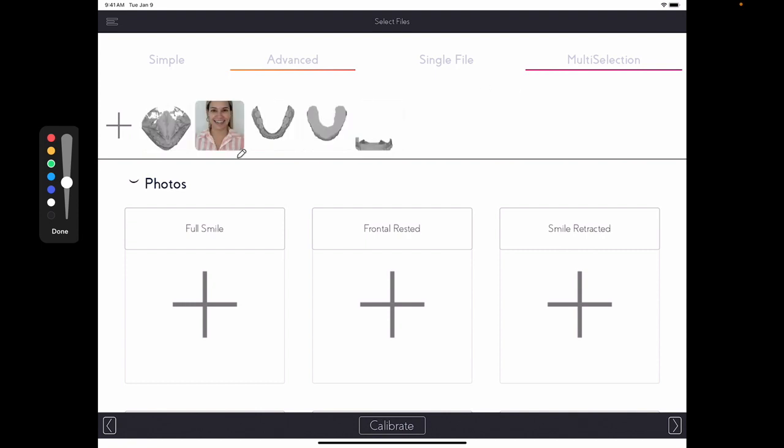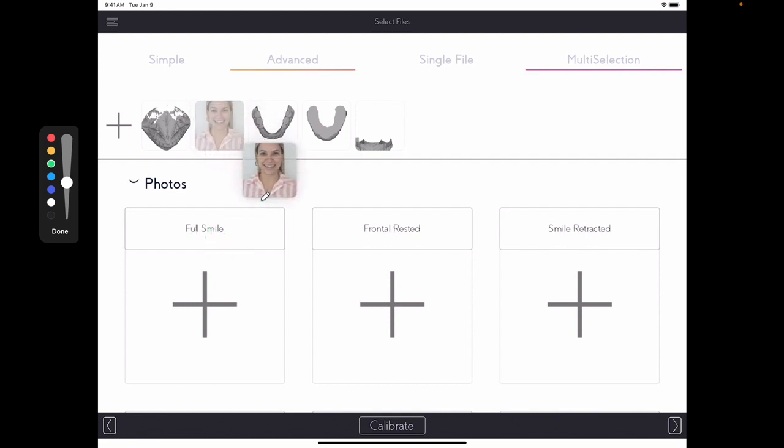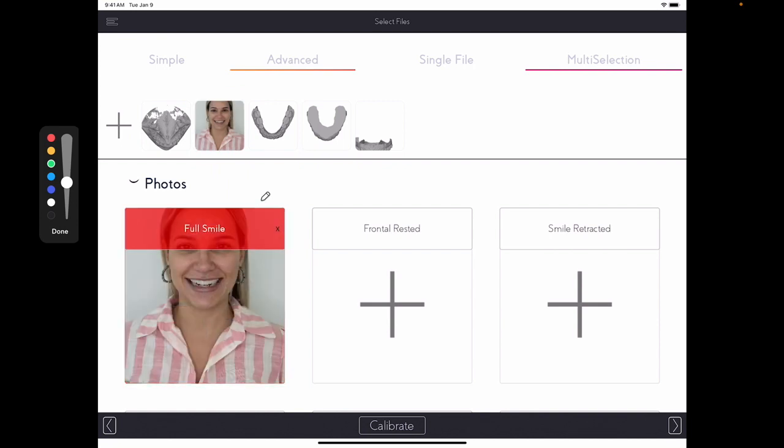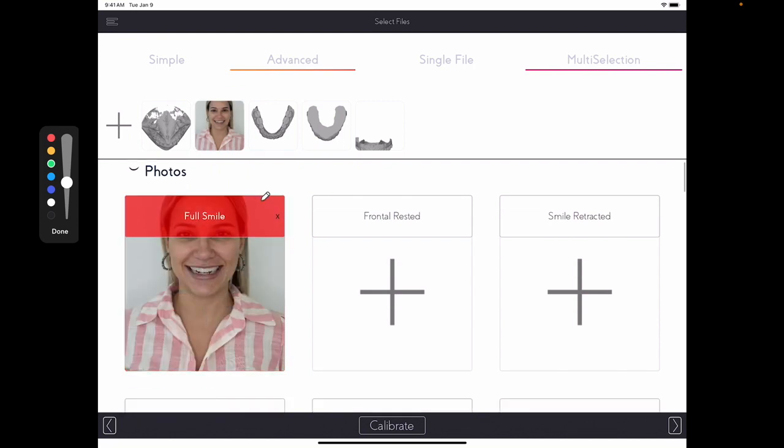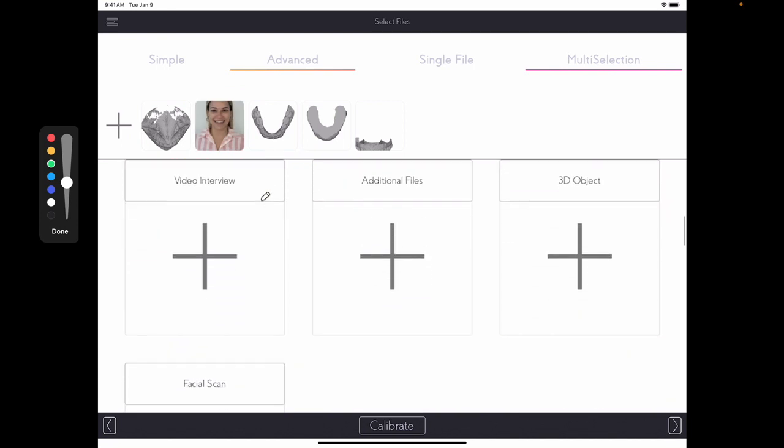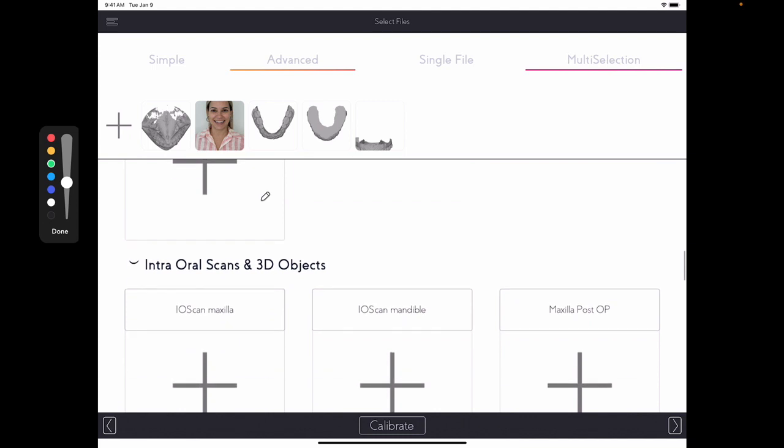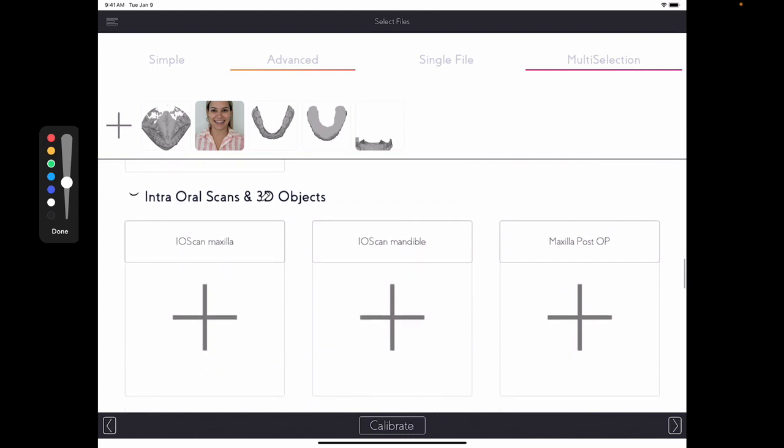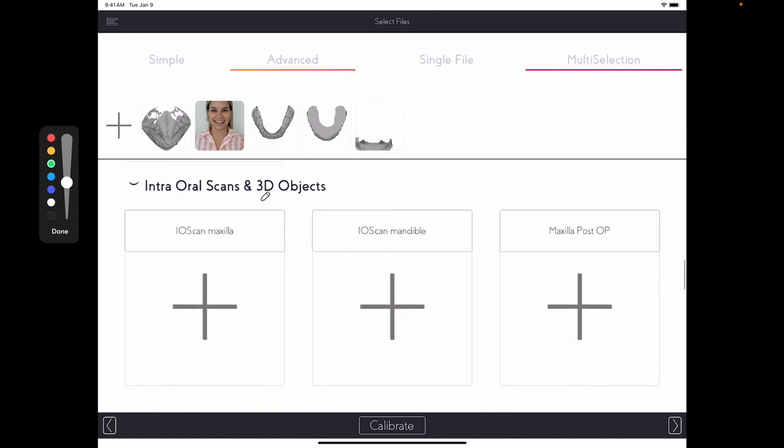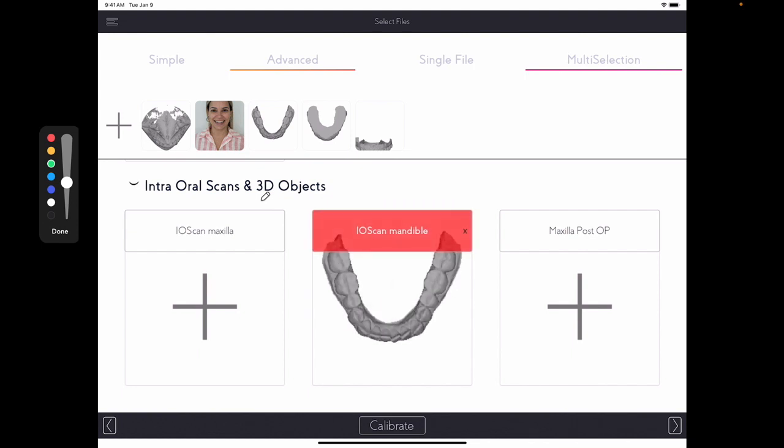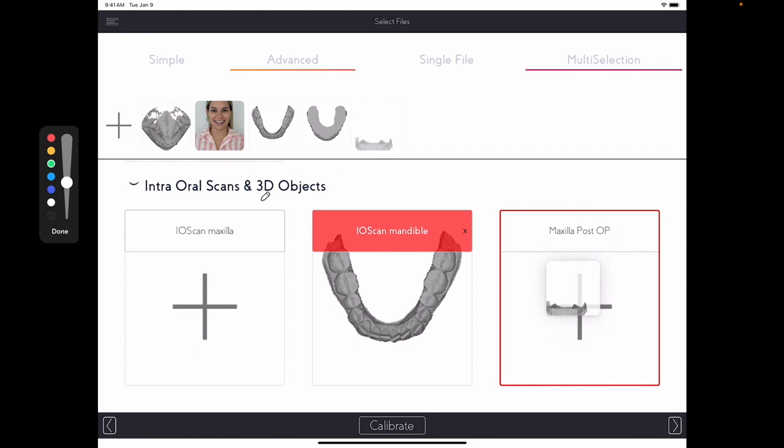Now all I have to do is to drag the file into the box. So here, for full smile, I'm going to press and hold and drag into full smile. Then I'm going to add my lower intra-oral scan. For the prep scan, you will use your maxilla post-op. That's where you add the prep scan.